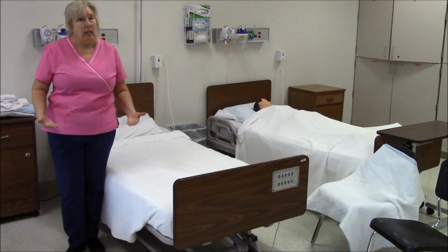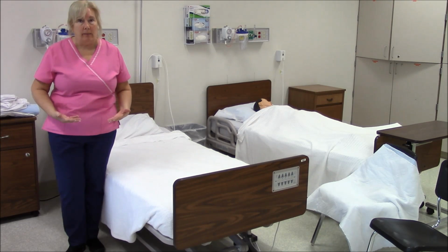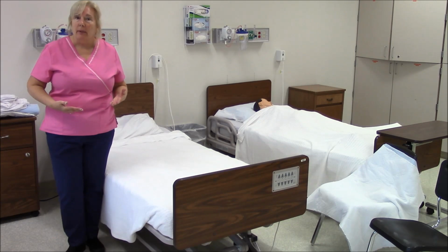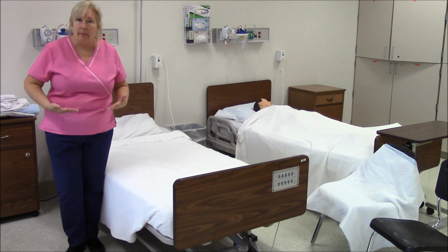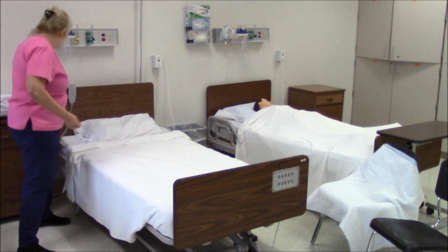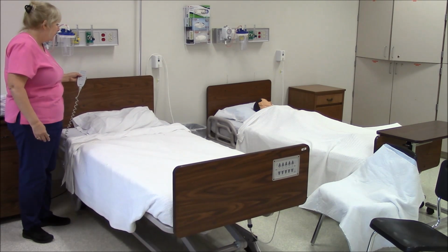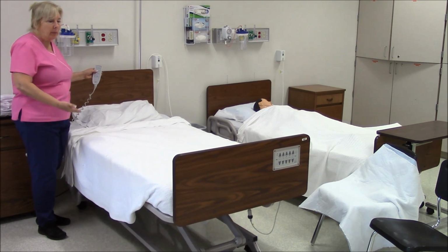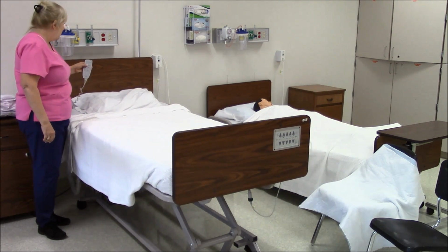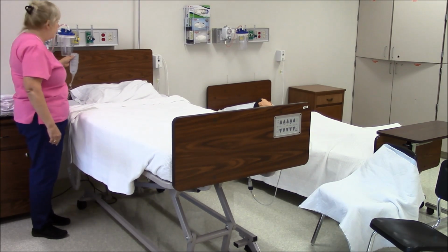As I carried the linen in, did you notice I did not have it up against me because I did not want to get it dirty. What I'm going to do next is raise the bed to a higher position, a position that is comfortable for me so I'm not bending and I won't hurt my back for this procedure. You would like the bed at a comfortable height where you don't have a lot of bending to do. And for my height, this is a comfortable position.